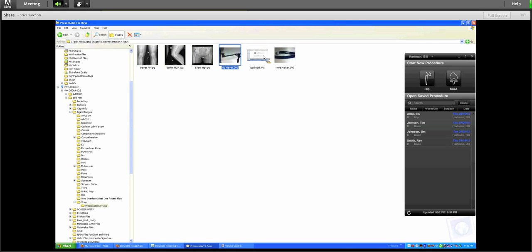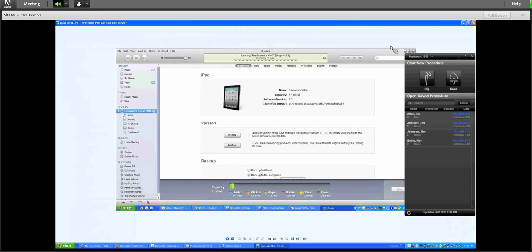What we're going to do is the guys, Chris and Bryce, are going to be getting with you, and I pulled up this screenshot. Because this is a development piece of software, it's not necessarily just sitting out in iTunes for everybody and their brother to go out and download. One of the pieces of information that we're going to need is called the identifier, the UDID number. That's something that most people aren't familiar with.